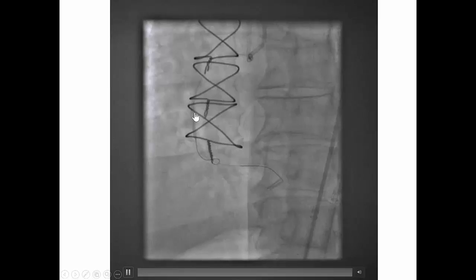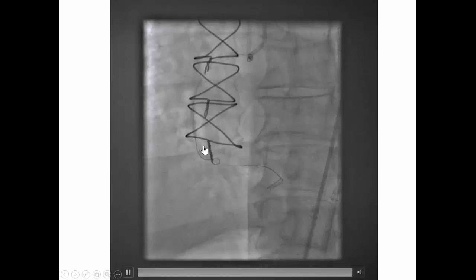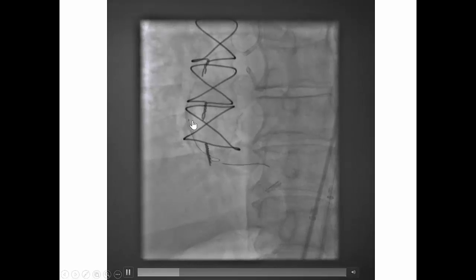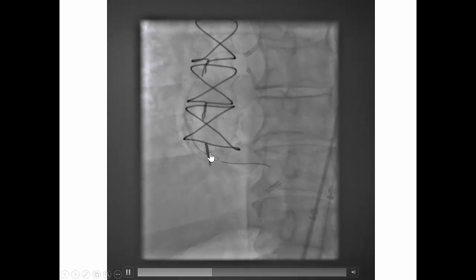So eventually, after we exhausted all these options, we decided to use a sub-intimal technique. We inflated a balloon in the mid-RCA proximal to the proximal cap and then created a small dissection that allowed us to advance a second polymer-jacketed guide wire alongside the first wire into the distal right coronary artery. We then inflated a balloon right adjacent to the proximal cap, essentially crushing the proximal cap from the outside.